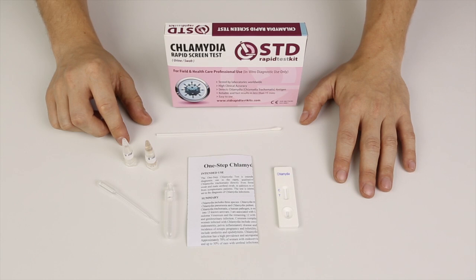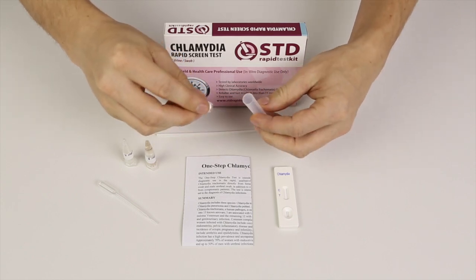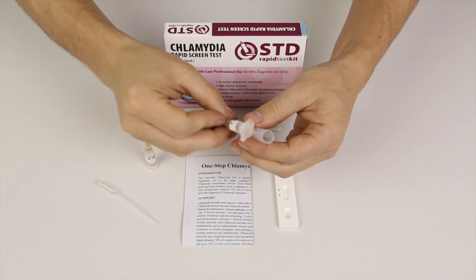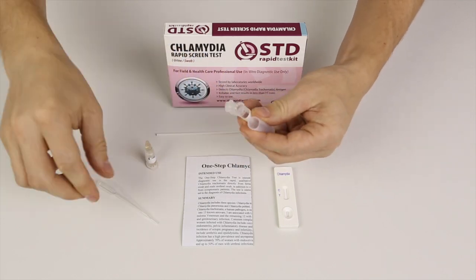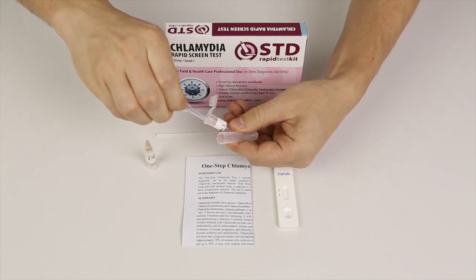The procedure for both males and females is the same. I'll show you that in detail later on. What I'll start off by doing is remove the cap from the mixing tube and take buffer A and open the cap.